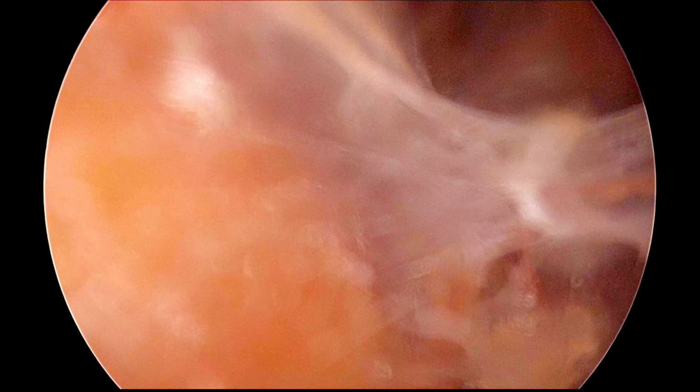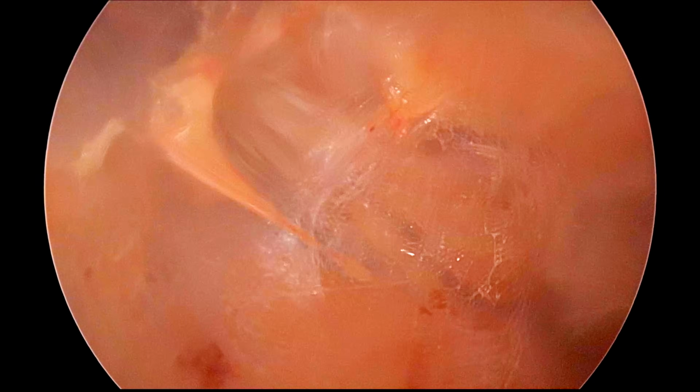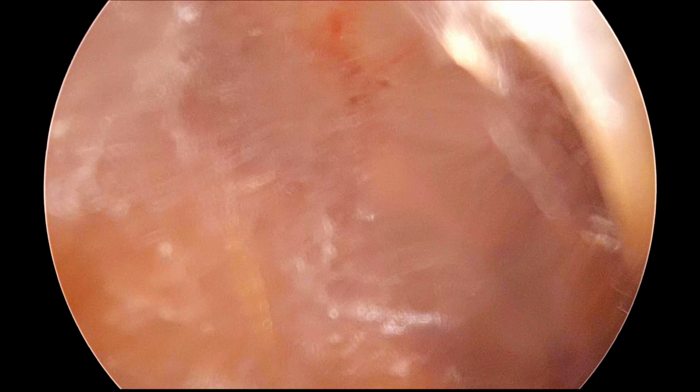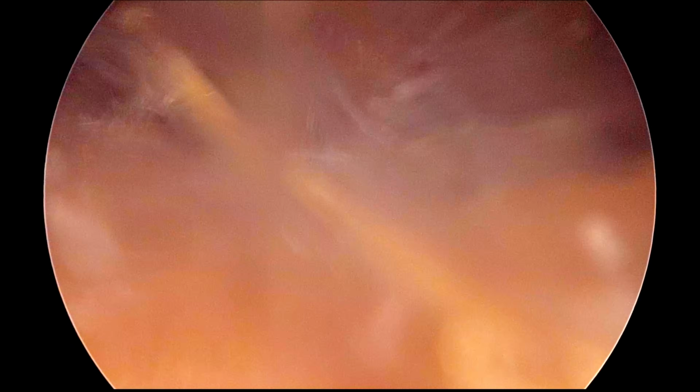We should separate the areolar tissue plane to go to the left side. During that process we should avoid any extensive uncontrolled movement. You can also use a balloon dilator. We can take a glove finger and make a balloon dilator, but even with the sweeping movement of the telescope it can be easily introduced inside.